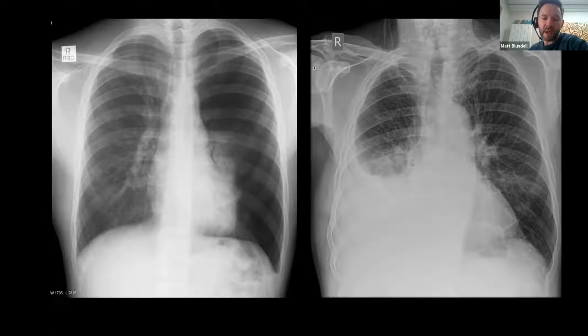Pleural disease is fairly common. We see a fair amount of it. And a lot of it is managed by sticking big, pointy, sharp things into people's chests, which does have an inherent level of danger and safety issues with it. So if we can be safer, we should be. And certainly using ultrasound can allow us to improve patient care and reduce the level of risk.